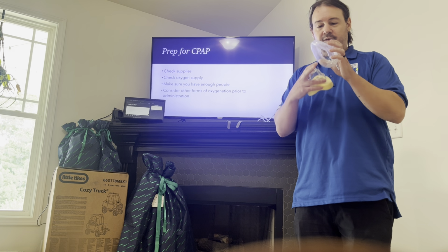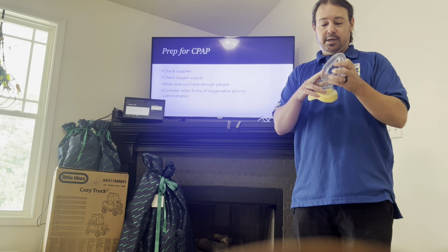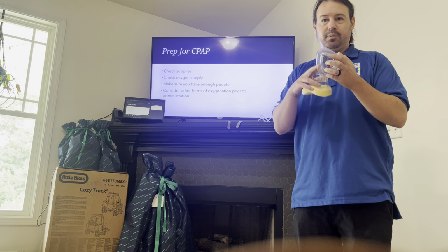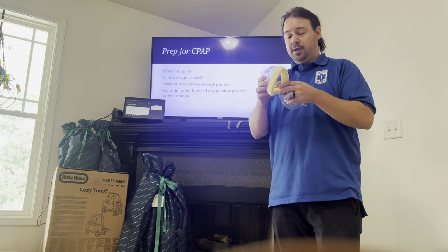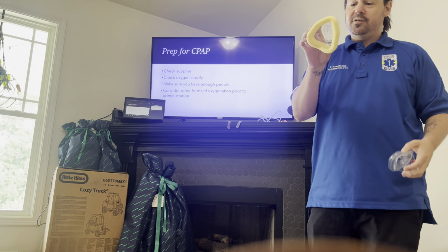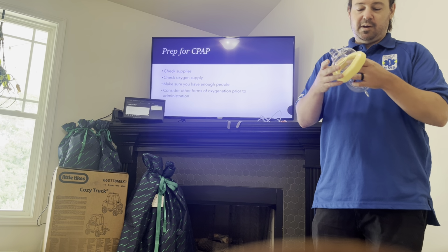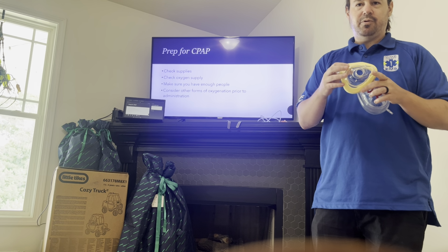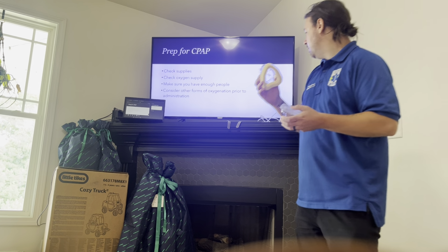Sometimes when you check these, you want to make sure that there's no hole causing leakage, or where the mask is completely deflated and it wouldn't actually sit on their face. These actually I find to give you a lot better seal with the foam mask, but sometimes if they've been sitting for a long time, that foam is pretty stiff and rigid and it won't actually adhere to the face all that well, so make sure we're checking your equipment.